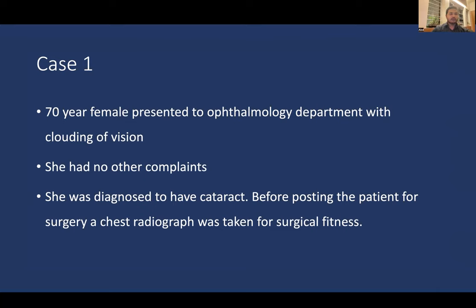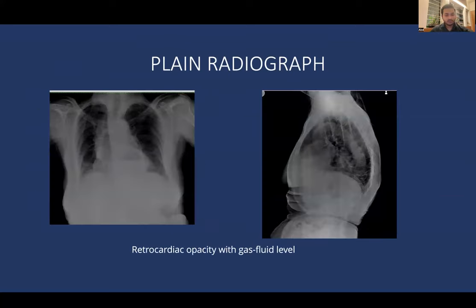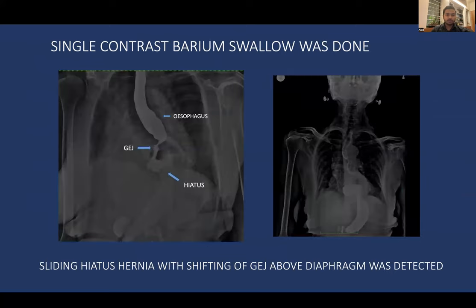Case 1: A 70-year-old female presented to the ophthalmology department with clouding of vision. She was diagnosed with cataract and a chest radiograph was taken for surgical fitness. The plain radiograph shows a retrocardiac opacity with a gas-fluid level on PA and lateral views. A single contrast barium swallow shows upward displacement of the gastroesophageal junction through the hiatal opening in the diaphragm, suggesting sliding hiatal hernia type 1.